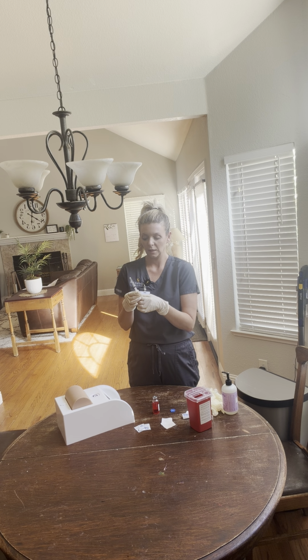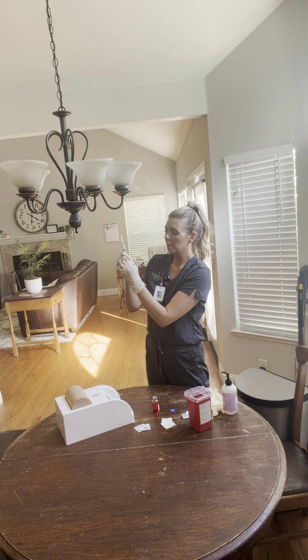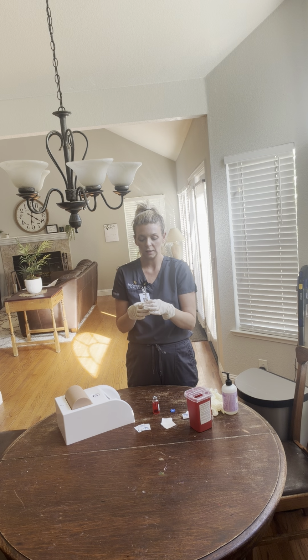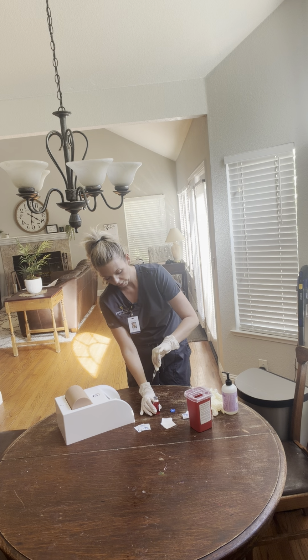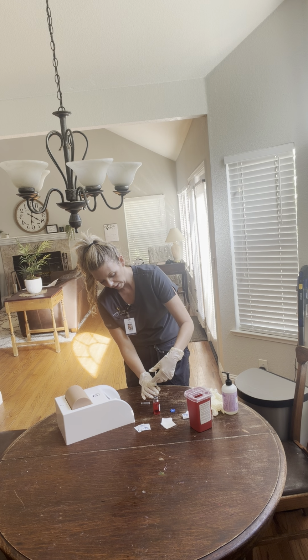Without uncapping the needle, I'm going to draw up 1.5 milliliters of air. And now that my vial has air dried completely, I'm going to uncap my needle. Oh, that's big. And I'm going to stick that into my vial and administer the air.